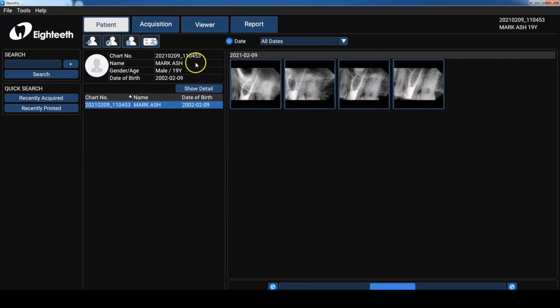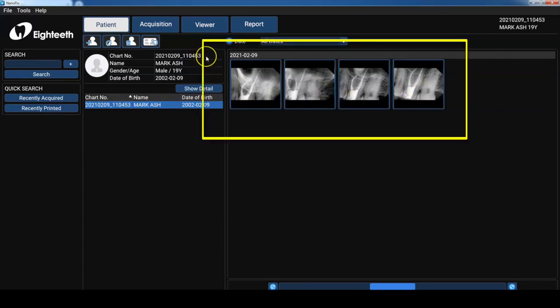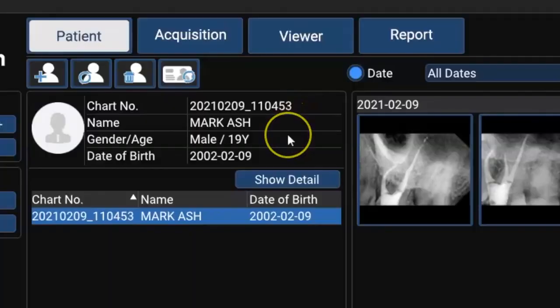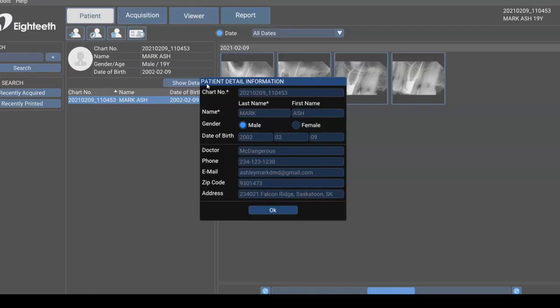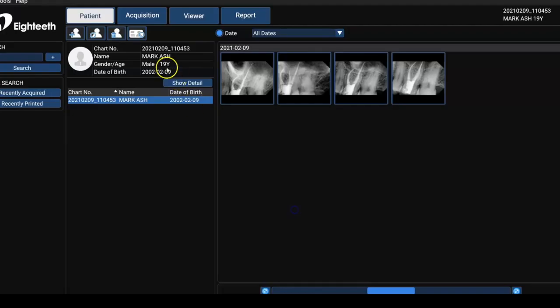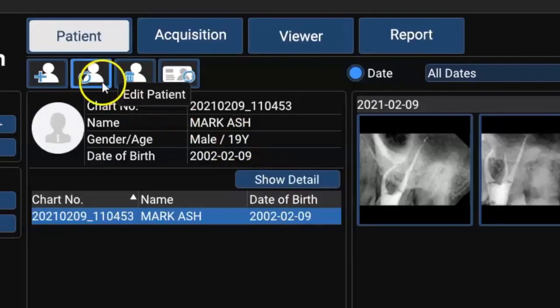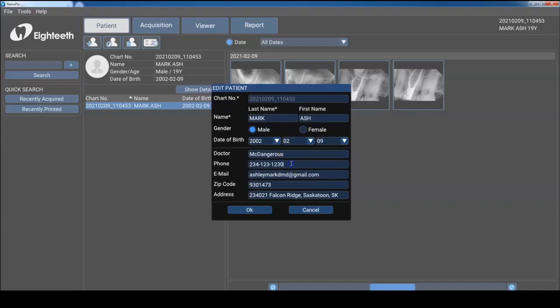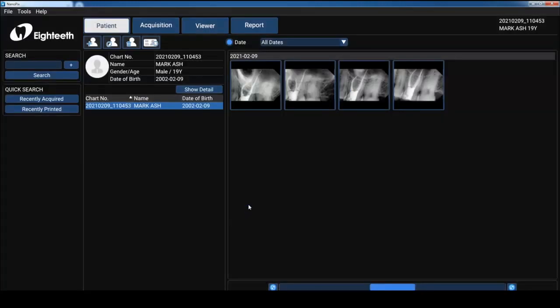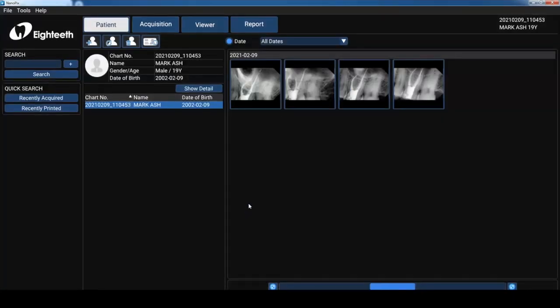From here you can see all the images that have been taken. All my secrets. There's my chart number. If you want to know some details about the patient you can just click show detail. But if some of those things have changed like their phone number, what you can do is just click on edit patient and adjust their phone number, their email, and any other things that you need to change.